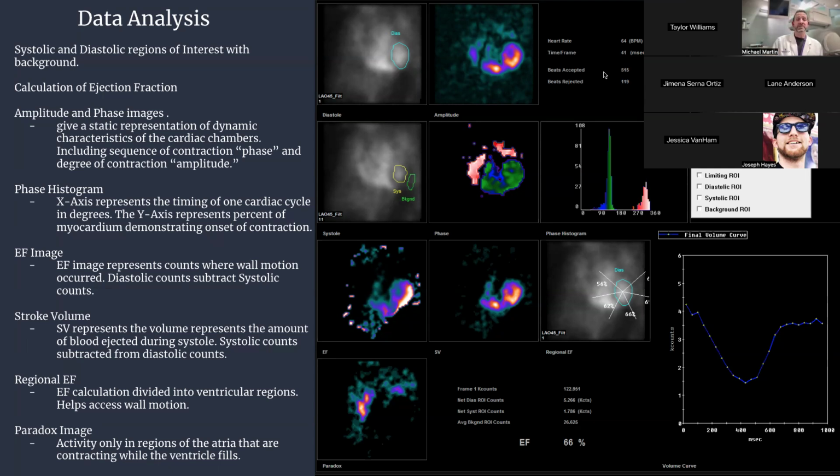One of the biggest ways that I see this happen is obviously you're going to run into issues with people who have some of the arrhythmias that we talked about, if they're in AFib or some of the things that make an irregular heart. But the other thing that can happen, even with someone that has a regular heart, is that depending on where your placement is of those leads, you can sometimes get a QRS that's kind of the normal size. And then I've seen EKGs where the T wave, for some reason, is really pronounced because of how that is triangulating that signal with those three leads.